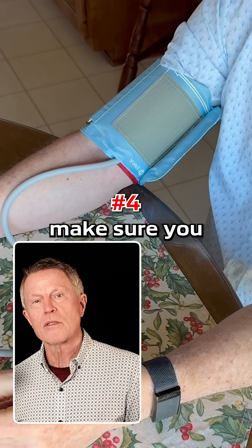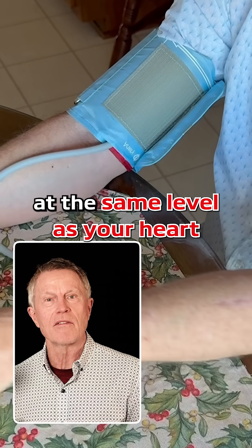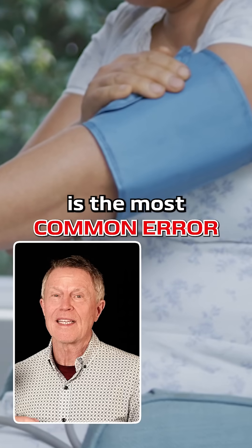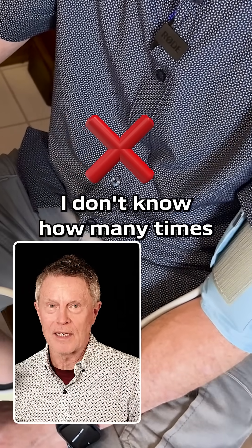Number four, make sure you place your arm over the table or another surface at the same level as your heart. This, by the way, is the most common error — I've done it myself, I don't know how many times.